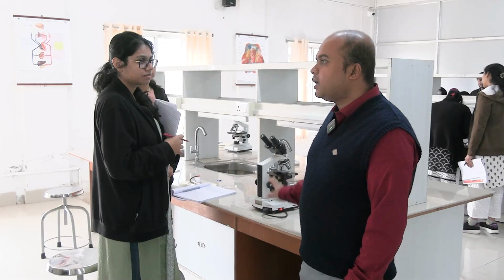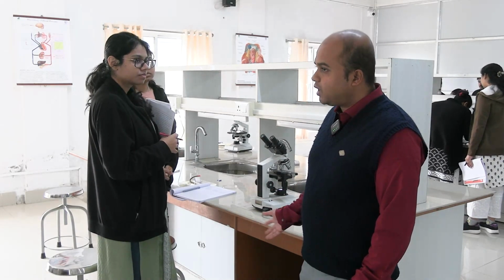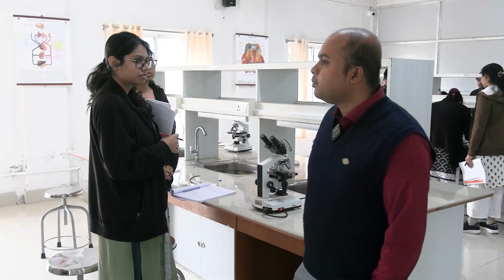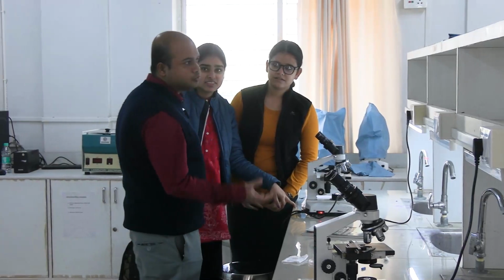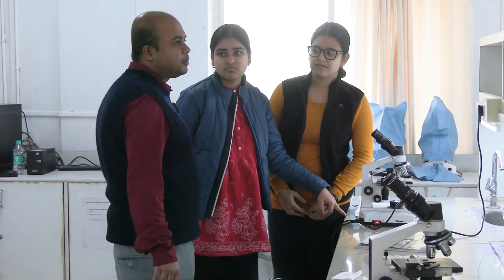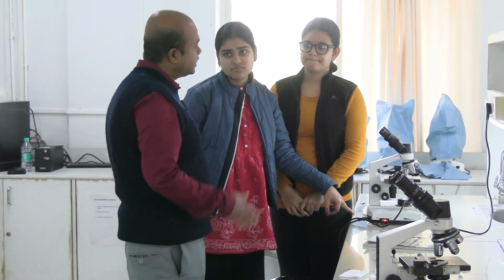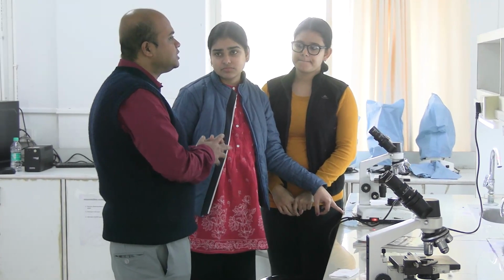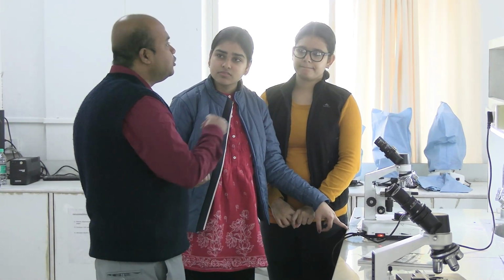So this blood has not been diluted properly due to faulty technique or whatever. Sometimes the same fluid is working for others. This is happening with those who are not diluting properly. If it is less diluted, the RBCs are huge in number. That's why the 200 dilution has been standardized. Now if you have taken blood and fluid such that it is diluted only 50 times, then the density of cells will be so much that it will not be possible to count.